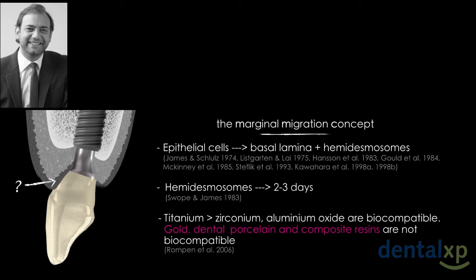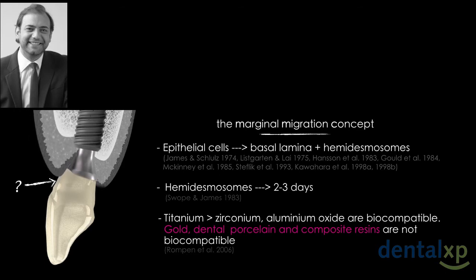In my experience, because we would like to have especially our first provisional restoration for a long period, 3 to 6 months, it is not stable, because these acrylic materials are porous materials and we might end up with trouble.